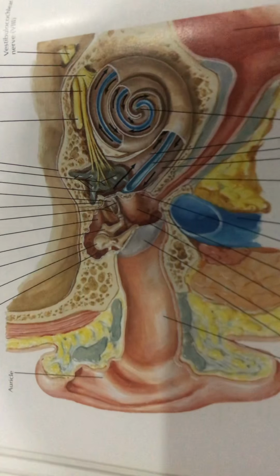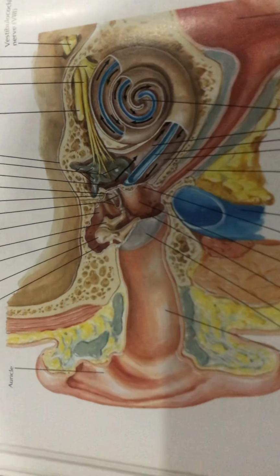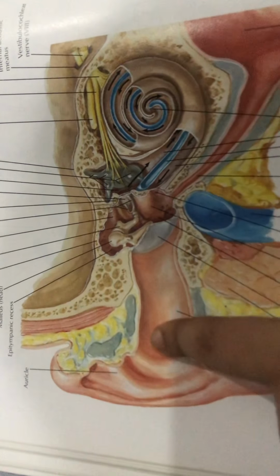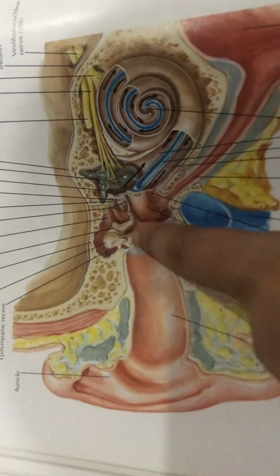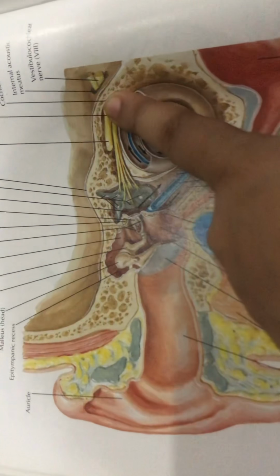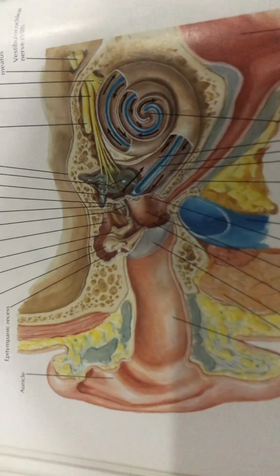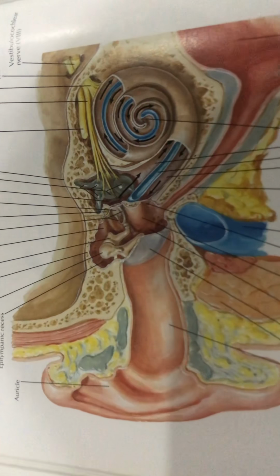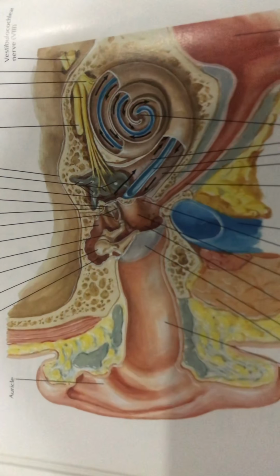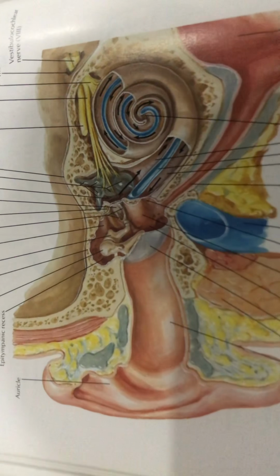Thus, any sound wave which is below 60 decibels or below 80 decibels, though it can get transmitted without a problem via the external ear, cannot stimulate the cochlea or the auditory nerve, so it does not ultimately reach the brain to get interpreted as a sound. Thus the air conduction also is plotted above 25 decibels, and there will be no air-bone gap in case of a sensory neural hearing loss.